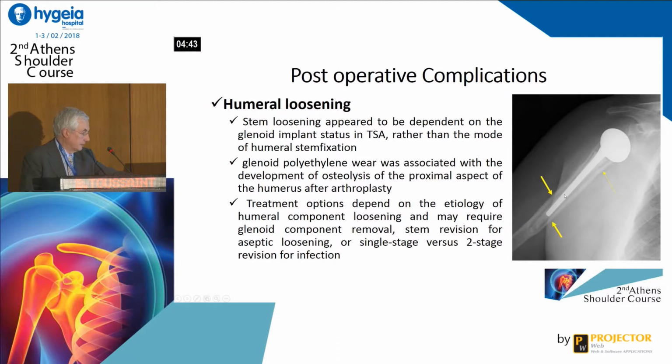And in this case also, it's very important to check for low-grade infection, because sometimes the aspect of the humeral shaft is very common for low-grade infection.